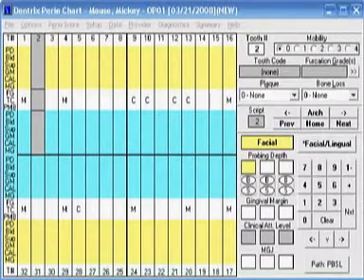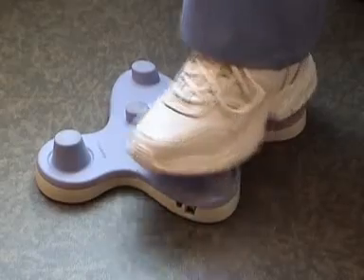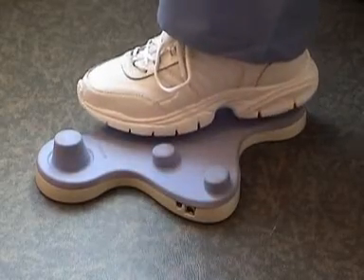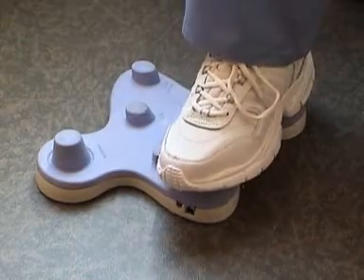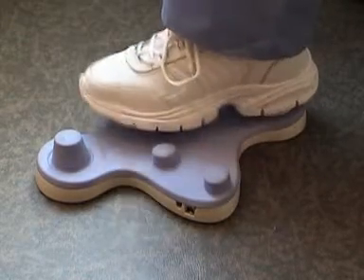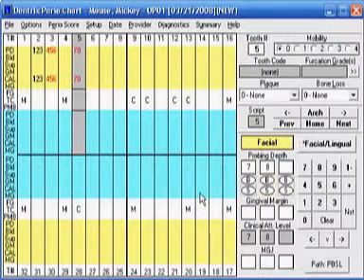This is the Dentrix Perio chart. You're now ready to begin perio charting. Across the middle of your Dental Rat you have the numbers one, two, three, four. If you hold it down for a second you'll get five, six, seven, and eight. Now if you have numbers higher than eight, there's a keyboard on your screen.